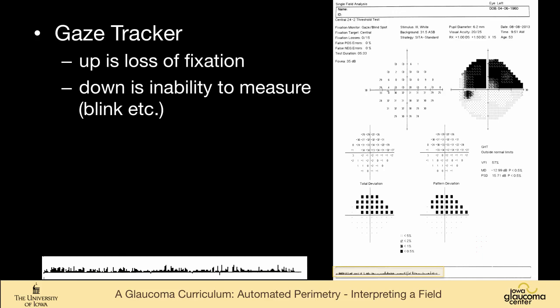An adjunct to that is the gaze tracker, in which the cornea is followed to see if the patient moves. You can see in this bar at the bottom, every time the patient moves, there's an uptick. And whenever the machine is not able to tell whether the patient has moved or not, then there's this downward fluctuation. It's remarkable to me how often fixation losses and the gaze tracker don't really go together.